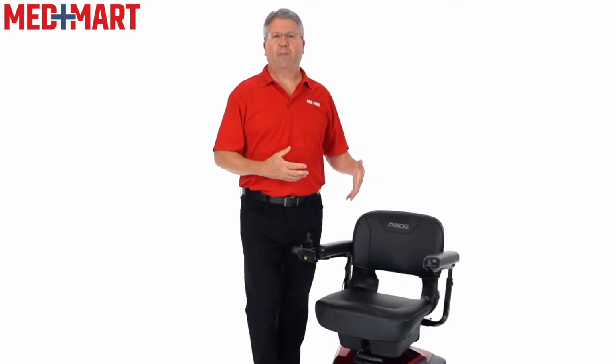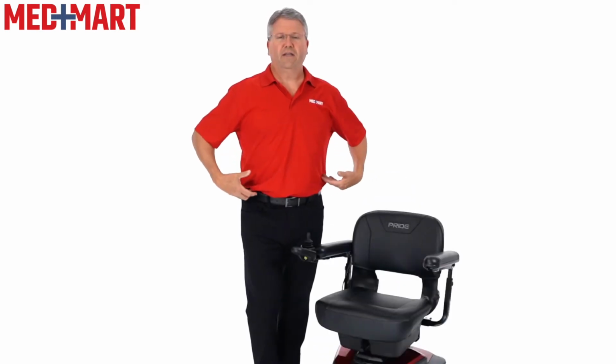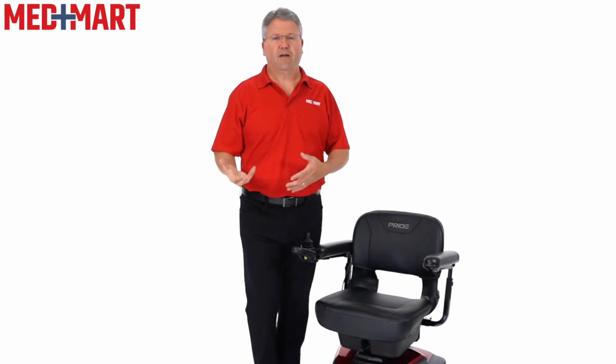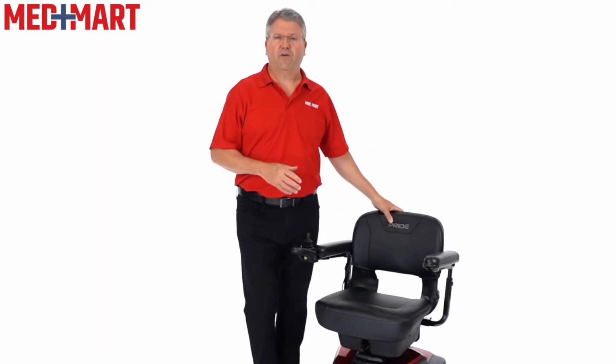I think the best way to think about this chair is that someone has to have at least enough core strength that they're not going to rely on the seat itself for support. So someone that maybe just has difficulty walking for some reason, going long distances, who needs a chair but is able to sit up fine in something like this. This is a great and very comfortable chair for that.